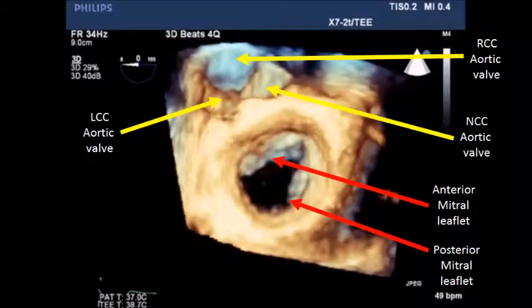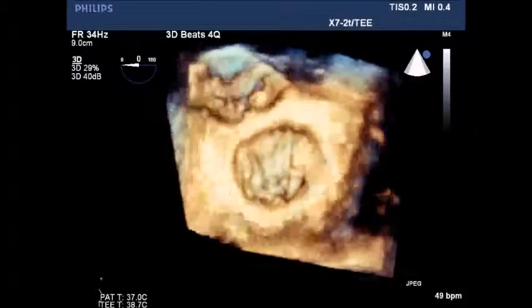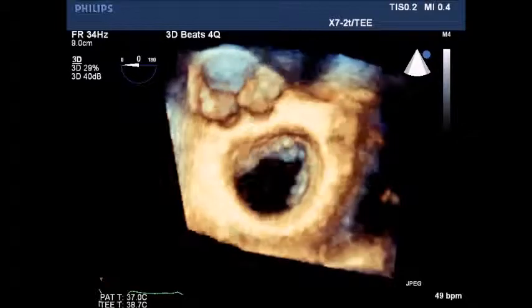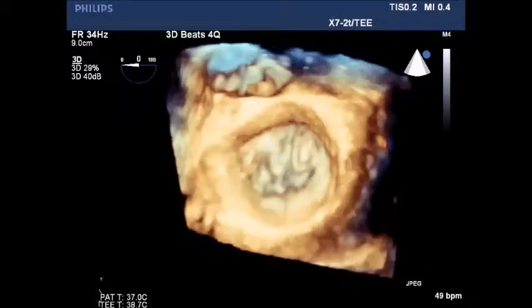The image has been rotated to show the mitral valve. Note the anterior leaflet of the mitral and the posterior mitral leaflet. Normal functioning mitral valve.